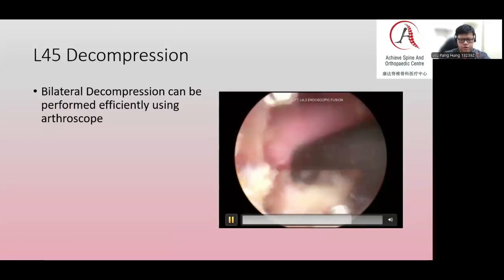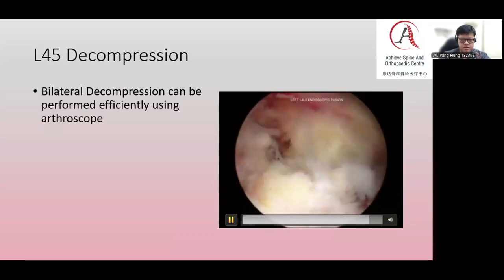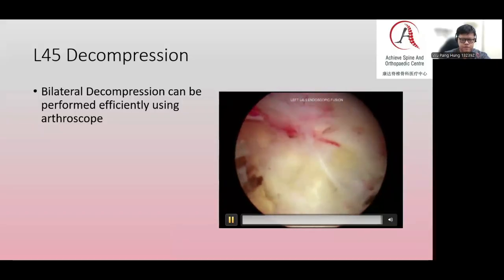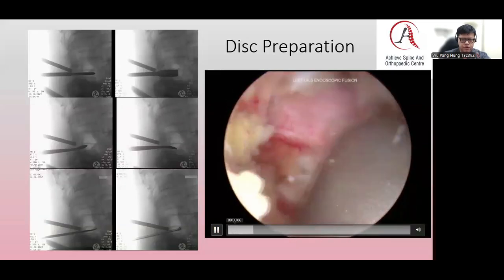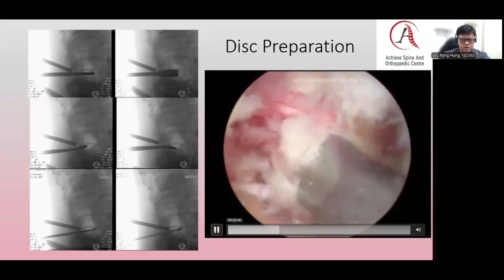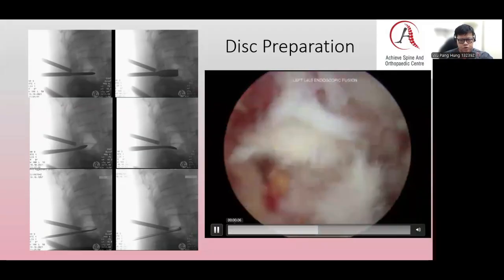The beauty of endoscopic fusion is that you can visualize very clearly where the nerve root is in relationship to the disc, where exactly the disc is, and also have less bleeding because of thorough hemostasis. Significant bleeding will obstruct the endoscopic view, so usually we would not let that happen. We will stop the bleeding before we proceed to the next steps. After that, we can use the shaver that's available from whichever instrument company you prefer to use your cage with.